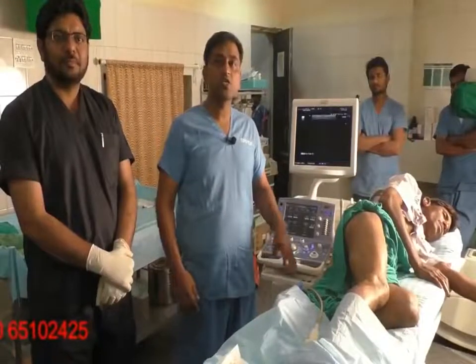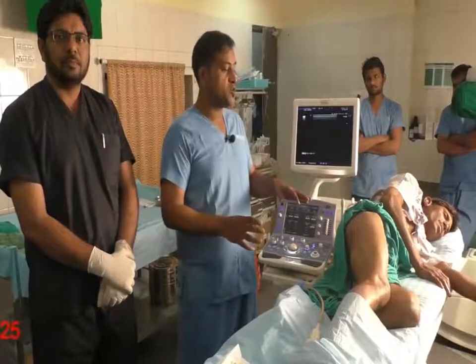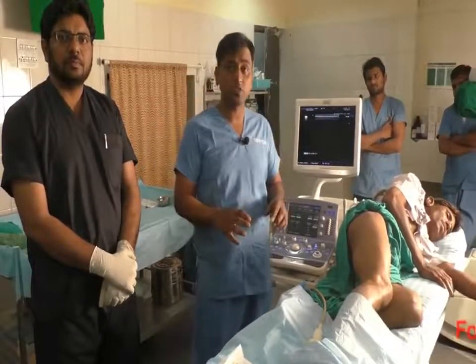Here I will be demonstrating how to do an endovenous laser ablation treatment. In this fashion we have planned to do an endovenous laser ablation treatment for GSV and SSV.